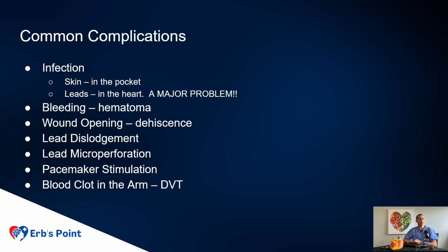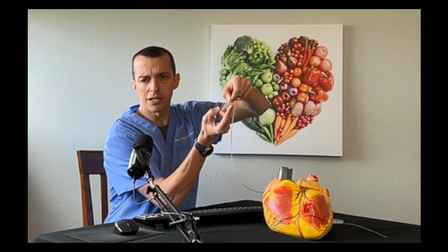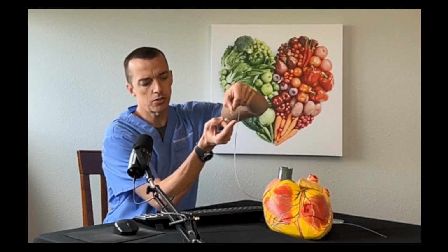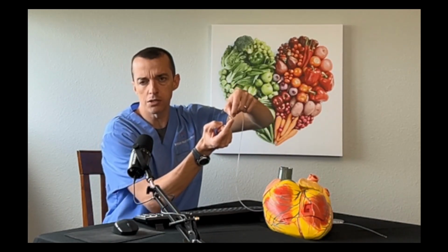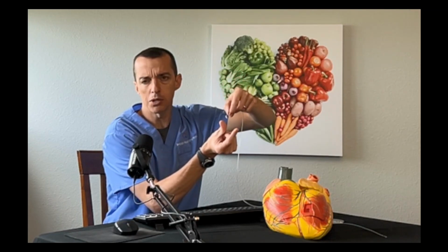Other things that you may not be aware of right away are these ideas of lead dislodgement or perforation. So dislodgement is not that you rip the pacemaker wire all the way out of the body, but just that you pull that pacemaker wire just slightly away from its point of contact. So if we've got it nice, and I don't know if you can see that well or not, but I've got it touching the skin surface there, so I would have it touching the heart surface. That's a good connection, and it's actually screwed in typically. But if you pull that back, now you've got a gap, and that can be a real problem.